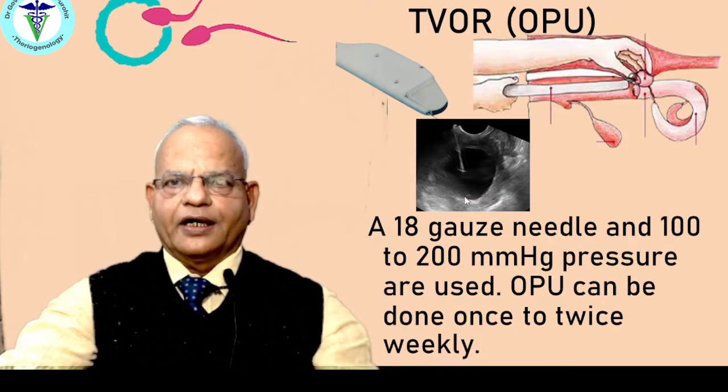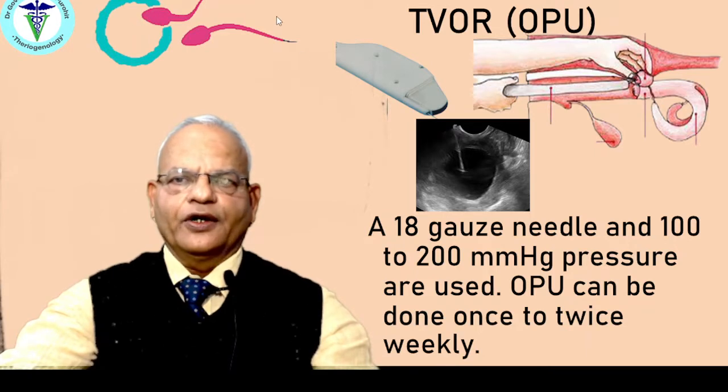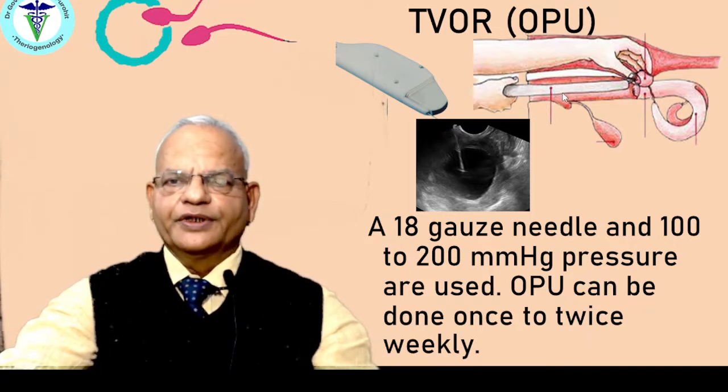Now, from a live animal, oocytes can be recovered. There is an ultrasound probe, which is a sector probe, and it has a long needle. You can see the needle over here, and it's very long. The ultrasound probe is introduced in the vagina. Just ahead of the vagina is the peritoneum, and one hand of the person is kept in the rectum and catches hold of the ovary.